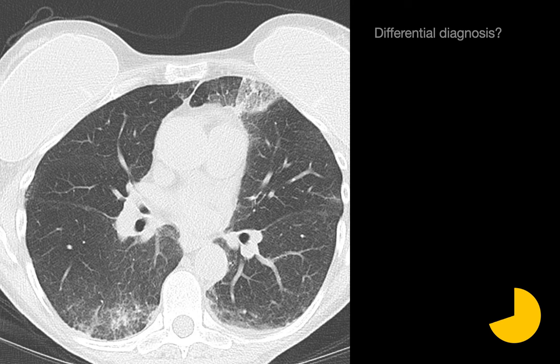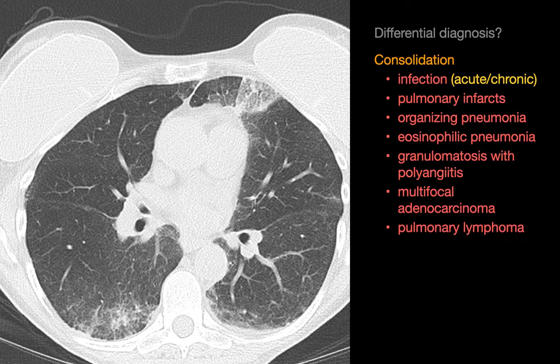What's your differential diagnosis for this case? The findings are multiple bilateral, predominantly peripheral lung opacities — mostly ground glass in character, but with some peribronchovascular consolidation and subtle interstitial features. Ground glass opacities are very nonspecific when they don't exist in isolation, so the most specific differential will be based off the consolidation. This non-diffuse consolidation could represent either an acute or chronic presentation, resulting in a union of the differentials for non-diffuse acute and chronic consolidation. Ground glass opacities can occur in everything on this list except pulmonary lymphoma.